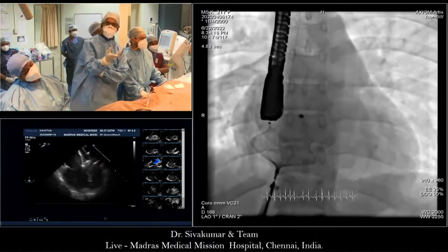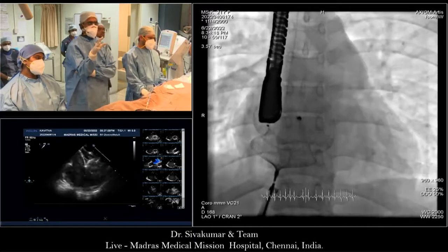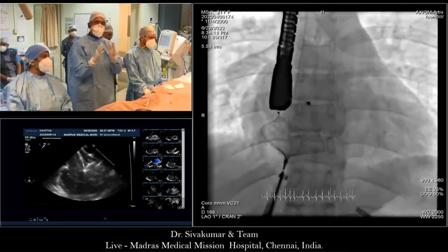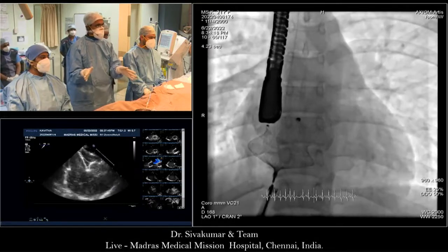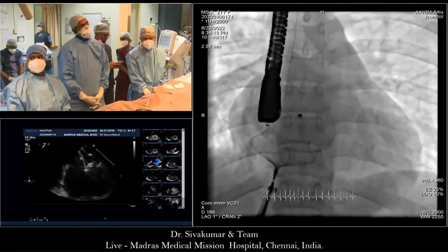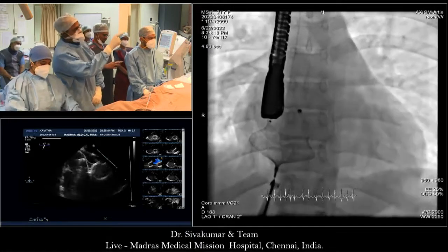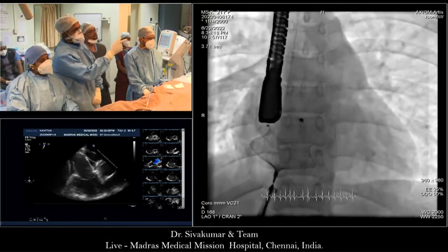LA disc and RA disc are in contact. That means that the device is optimally sized. If the patient has an absent retroaortic margin, it has to flare on the aortic end. So that is the only place where it is flat. If I had oversized this particular device, the posterior discs would have been separated out. Inferior disc would have been separated out. Now we are having posterior and inferior margins touching each other. So I do agree with many of the experienced operators, but this looks actually good to me. In fact, now on transesophageal, the posterior-inferior margin that Srija is showing now, the two discs are touching each other. This means that it is not oversized.